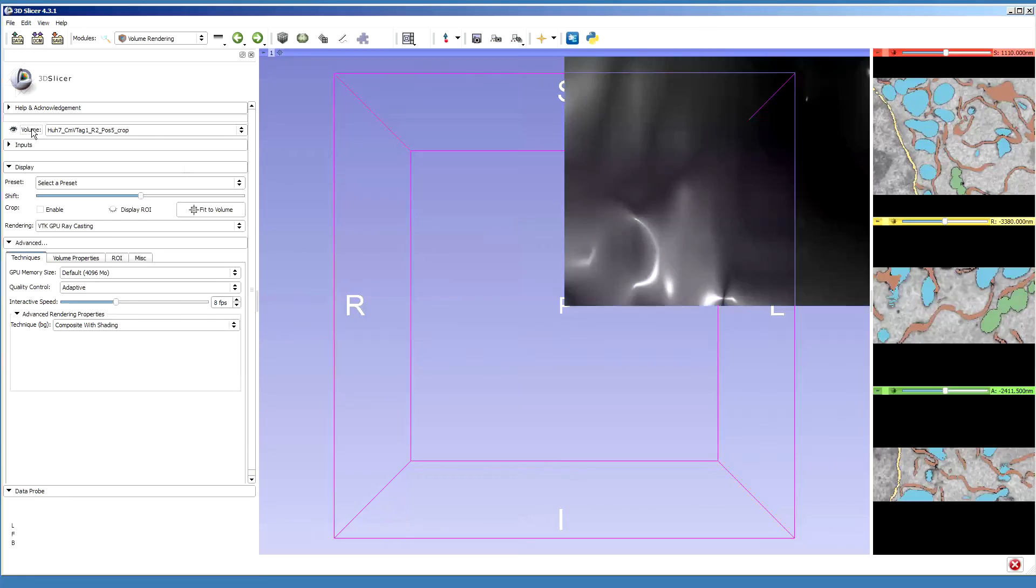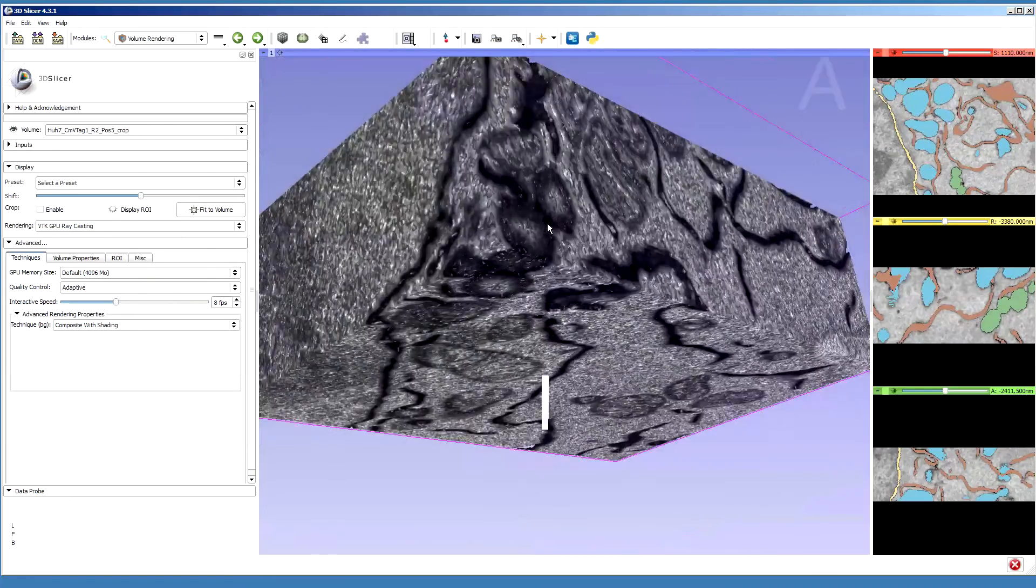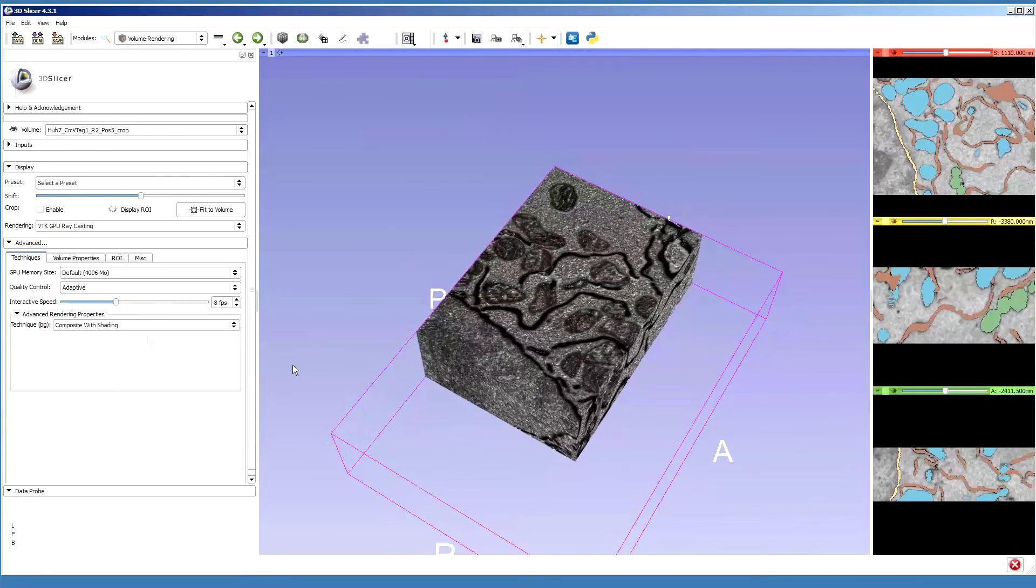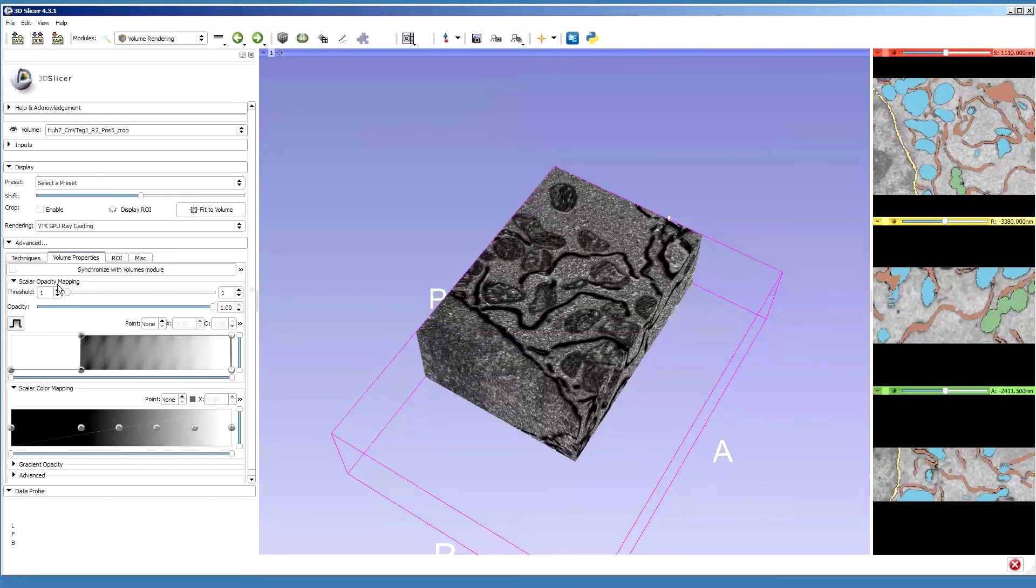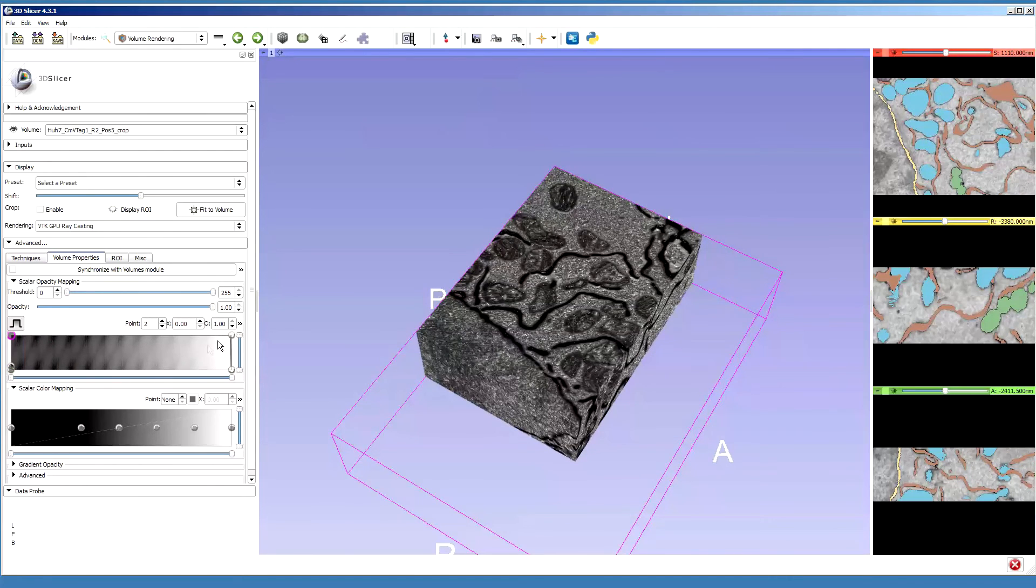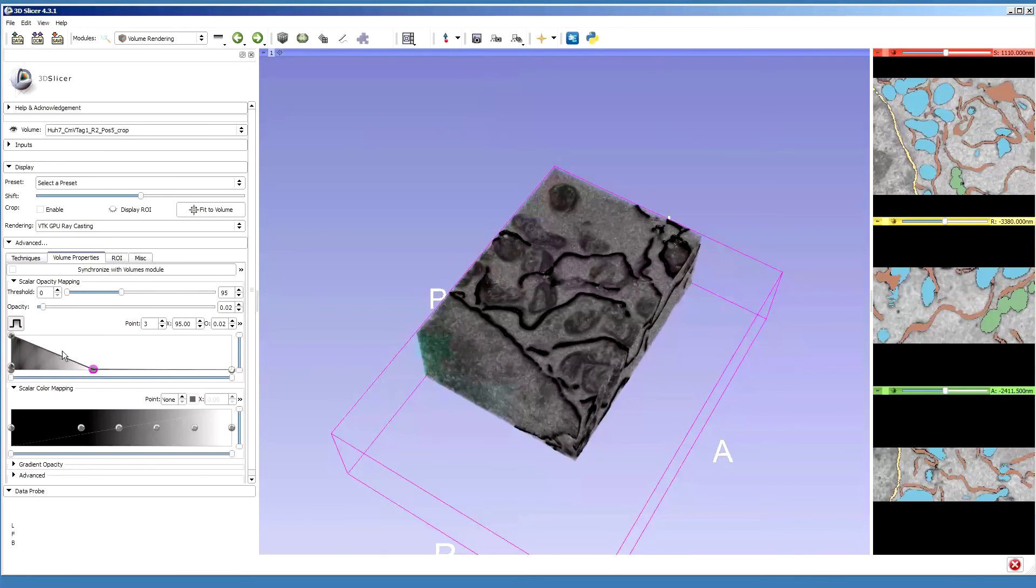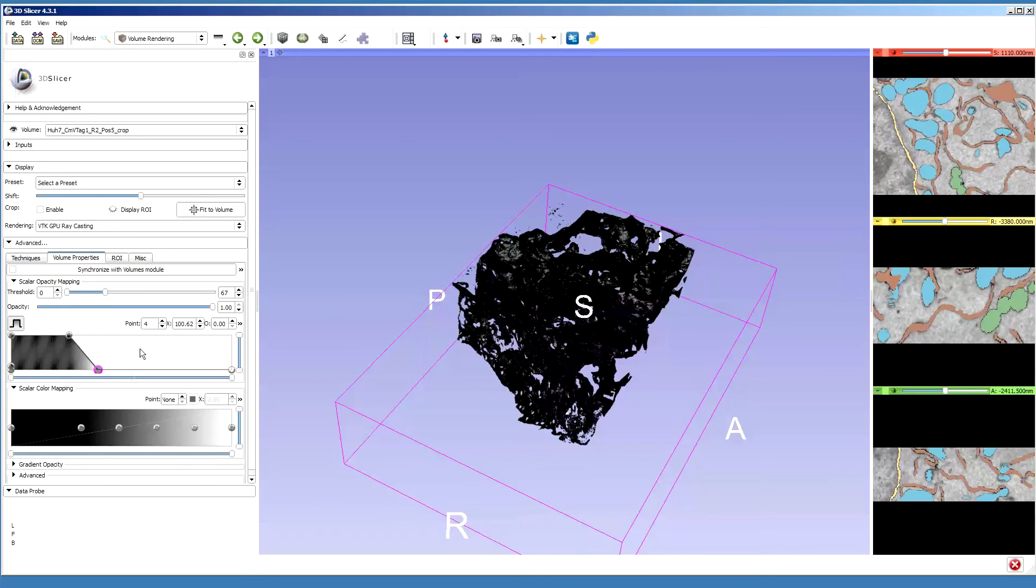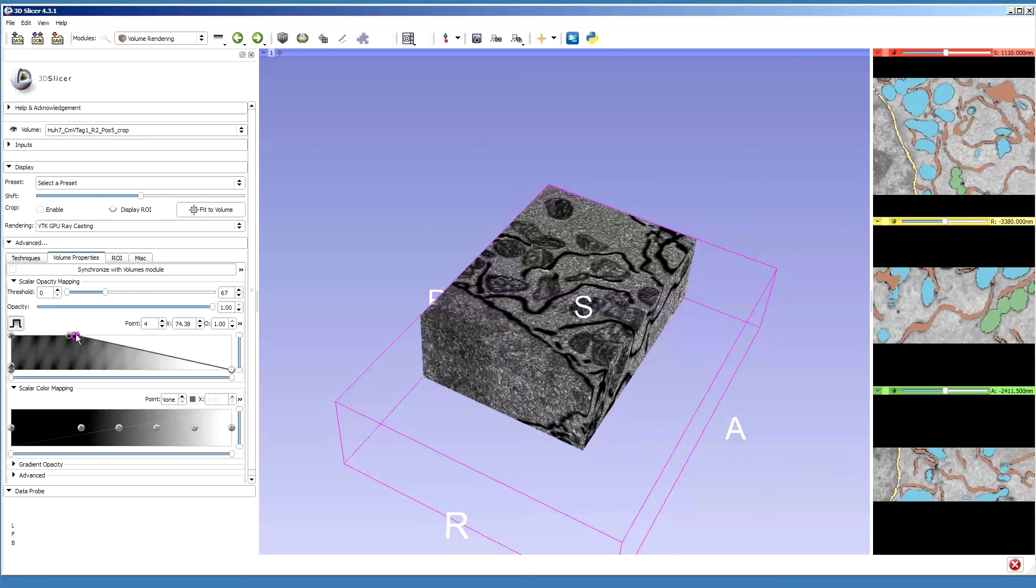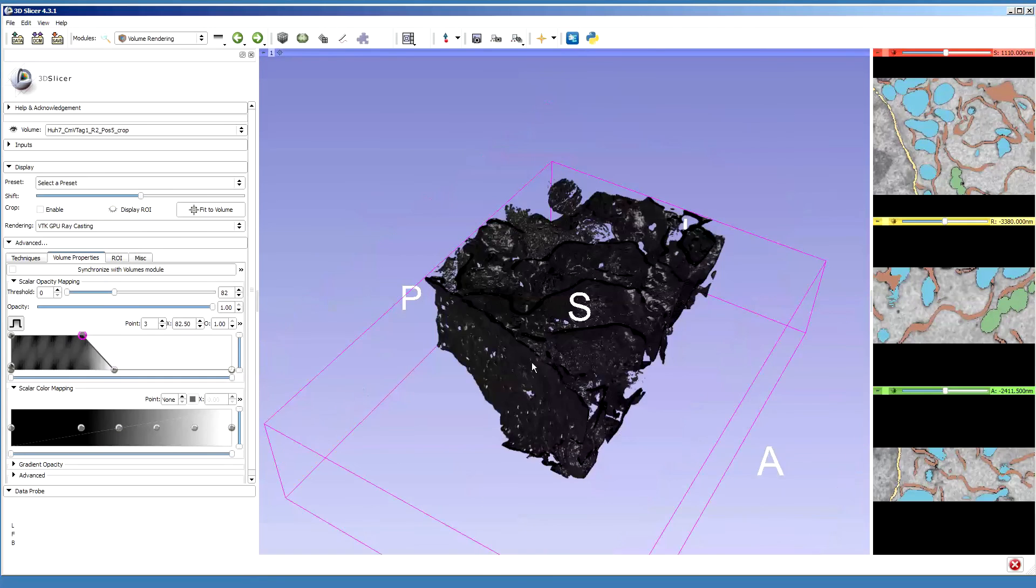I need again to modify the transparency for this, choosing volume properties, just to make sure I see the structures I like.